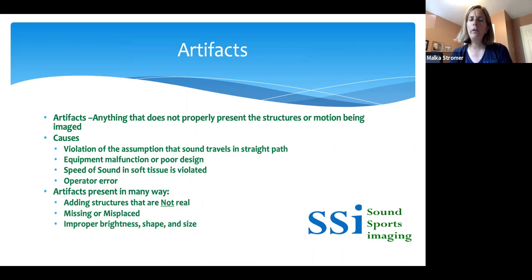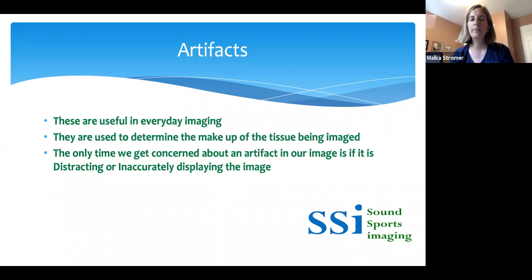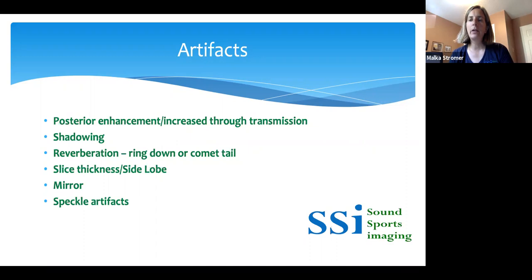Artifacts are incredibly valuable findings on ultrasound and help us distinguish soft tissue masses based on what we're visualizing. Artifacts are not real, but they provide us with information on the content and structure of the tissues we're looking at. They're useful in everyday imaging and used to determine the makeup of the tissue being imaged. We only get concerned about an artifact if it is distracting or inaccurately displacing the image. Here are some examples of artifacts that are helpful when trying to determine tissue makeup.